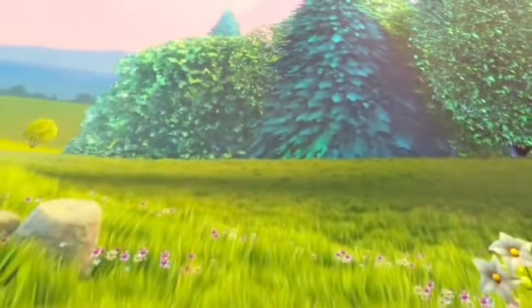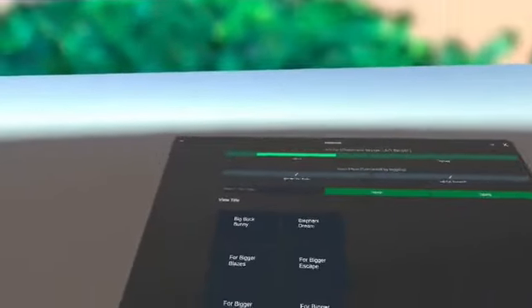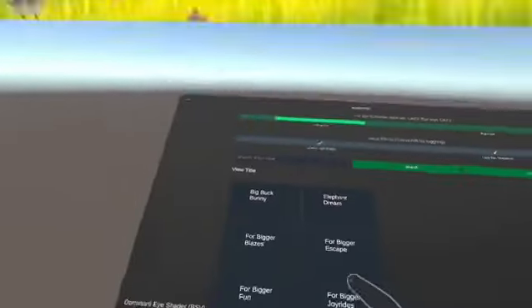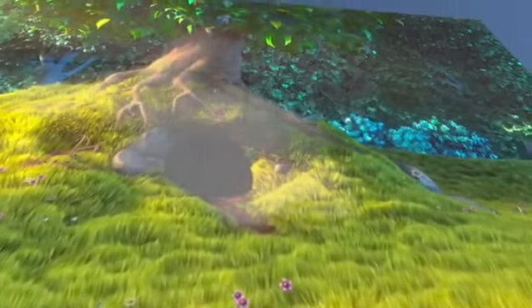let me just play another video and show you. Okay, so if you increase the sharpness, then the sharpness also increases, and now you can see some kind of flicker. This flicker you can increase also. Okay, so this is very important, and this is a selective flicker. So if you see something like a human object or some objects, now see this is a kind of flicker you will see on a human object, and this is very catchy, and this is very important for the neuroplasticity.